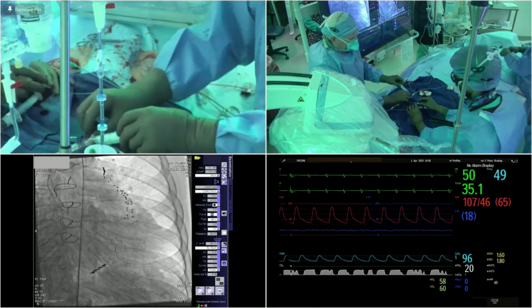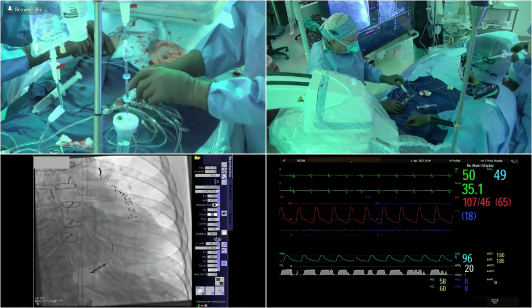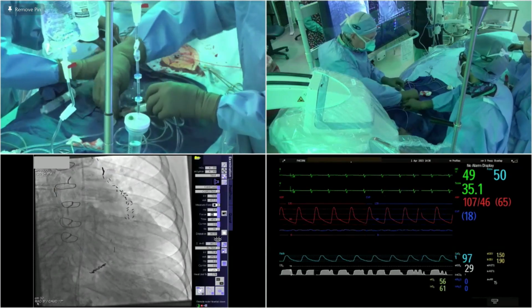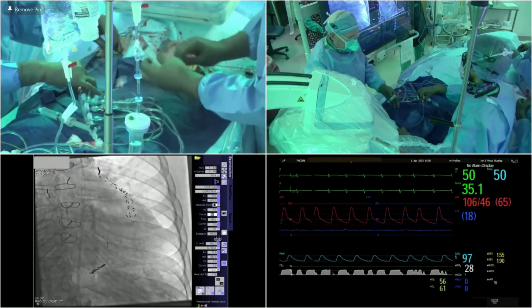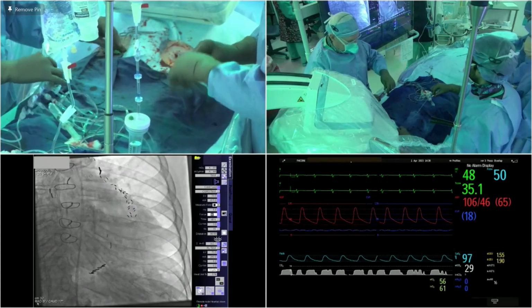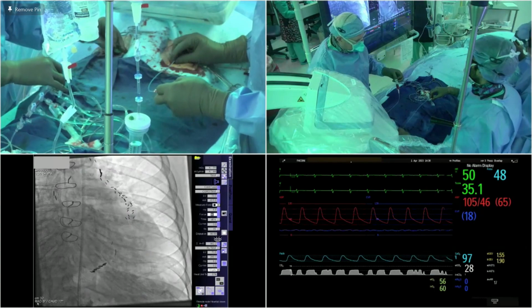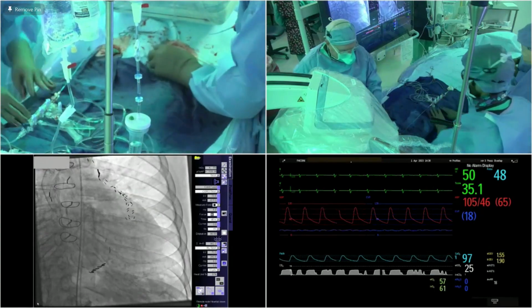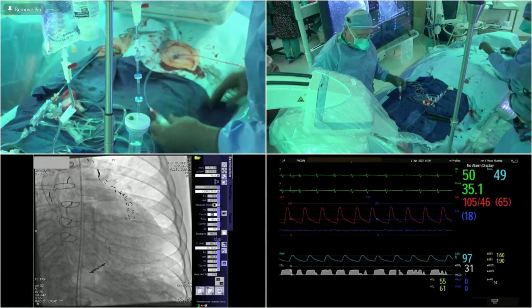We put a temporary pacemaker in on the femoral vein and have it for two reasons. One, to rapid pace for balloon inflations, and also in case there's heart block. Lately, on selected cases, we've been pacing off the wire that we have in the left ventricle for the TAVR deployment. So we'll be doing that here. Do you have the alligator? Okay. Ready to inject for 10.